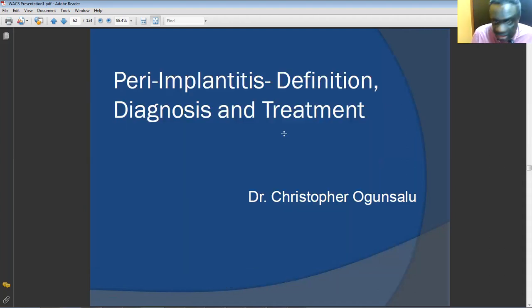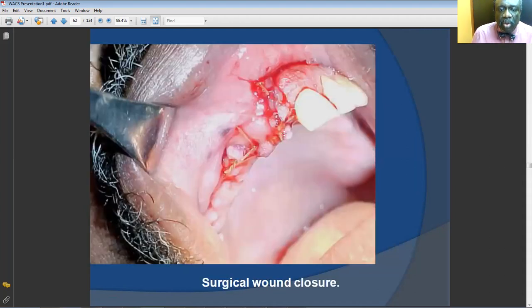So that's watertight suturing. Now, when you drill to place a 12 mm implant, and you didn't drill completely to 12 mm, and you only drill 11 mm or 10 mm, and you're trying to force the implant further apically with the driver, you are putting undue pressure into the osteotomy site.